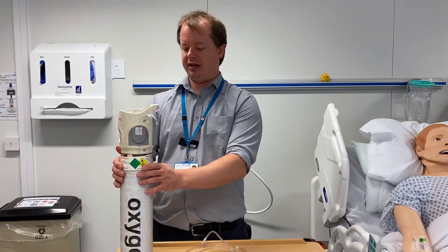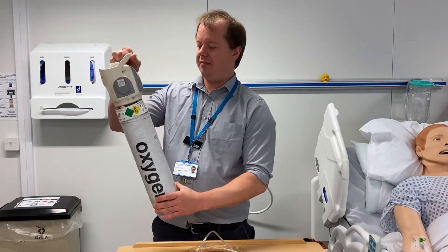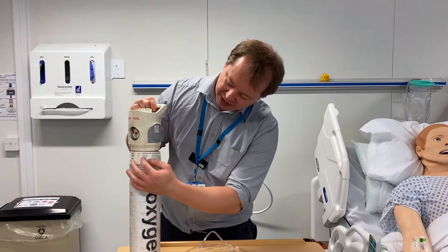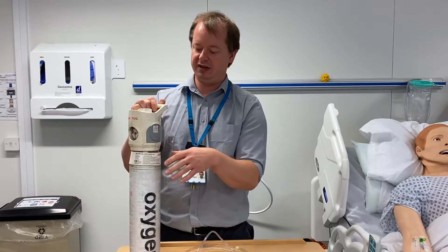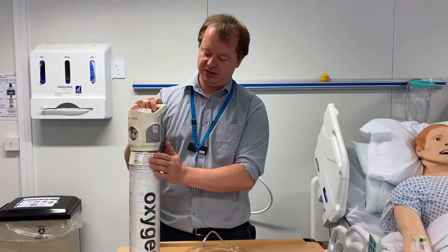This is a cylinder that contains oxygen. The way we know that is not necessarily the big word 'oxygen' on the side — it's actually the collar around the cylinder. On the collar you'll see it says 'medical oxygen', and that's what we need to look at to know what we're giving the patient. There are other cylinders in the trust — nitrous oxide, carbon dioxide, or air — so we need to make sure we're giving the patient oxygen.